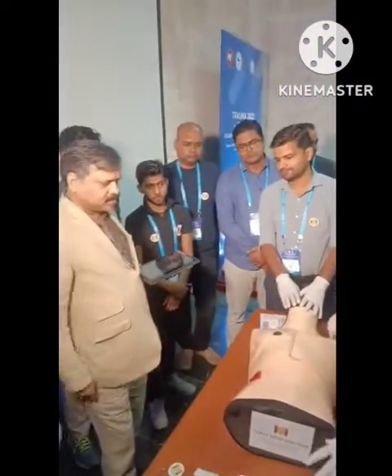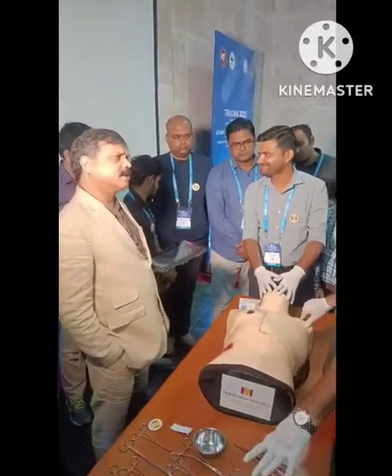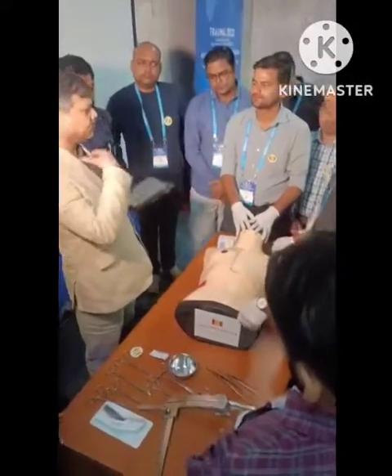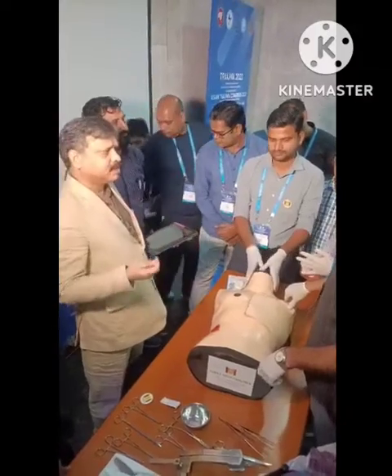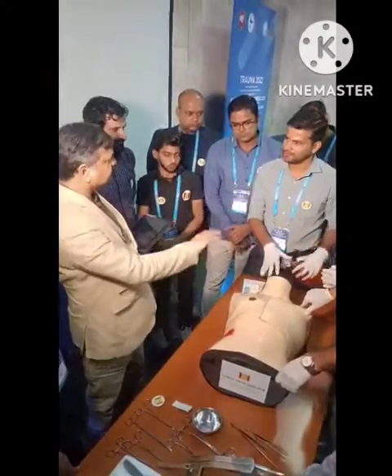Okay, tell us the ED thoracotomy set usually. We will use the word RT because this is resuscitative thoracotomy. The patient has died. मतलब सब लोग इसे resuscitation basically. ED नहीं, हम resuscitative thoracotomy कहेंगे. Okay, so we will just simulate.